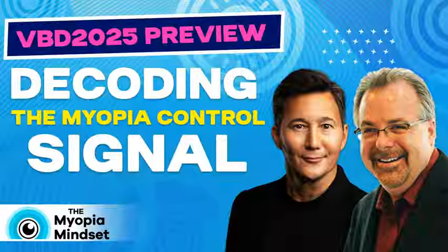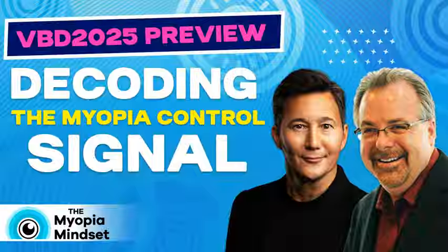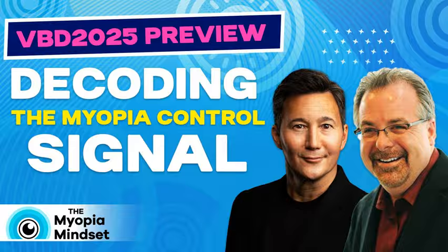Just as an example, Matt, in regards to your customization, should a patient with a pupil this big have the same optics as a patient who has a pupil this big or this big? The amount of customization, it's so deep in how we can approach each and every eye. And that's just talking about pupil size, how the epithelium responds. And if they have astigmatism, how you might alter the effect, not just across the flat, but across the steep. So there's all kinds of ways that we can be appropriately designing the lenses to match each patient's need. And that's not something we've historically done, right?